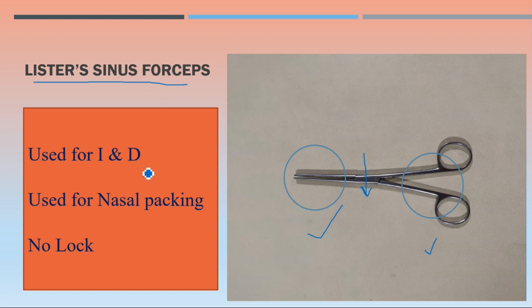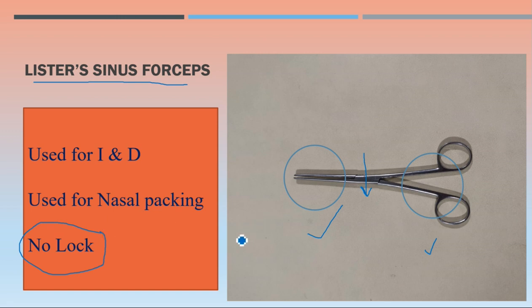Lister sinus forceps is used for incision and drainage, like in Hilton's method of incision and drainage. It can also be used for nasal packing. The important thing is there is no lock. Any instrument looking like this with no lock is Lister sinus forceps. In India it is also known as six-month forceps — please be able to identify this instrument.